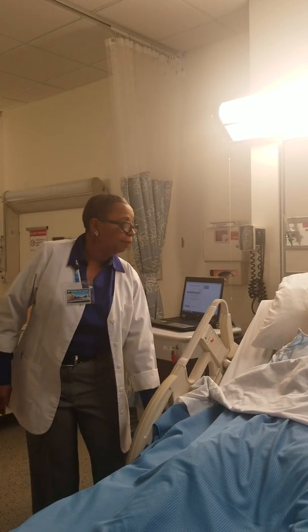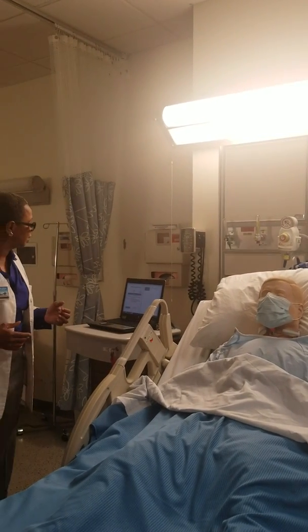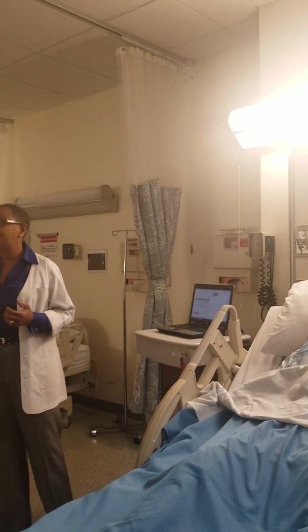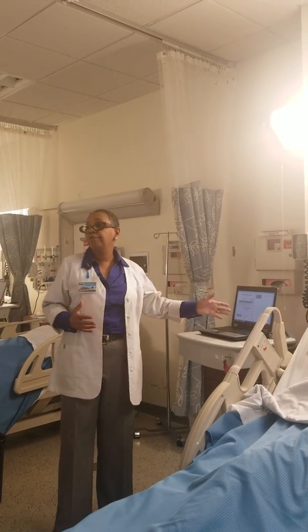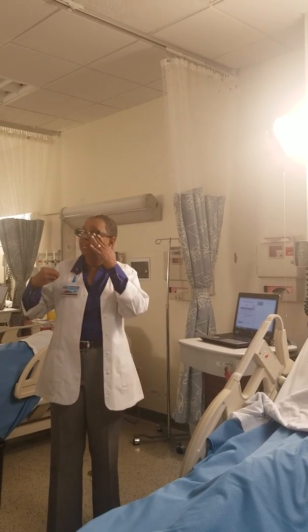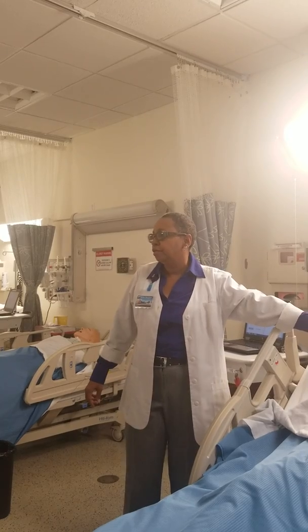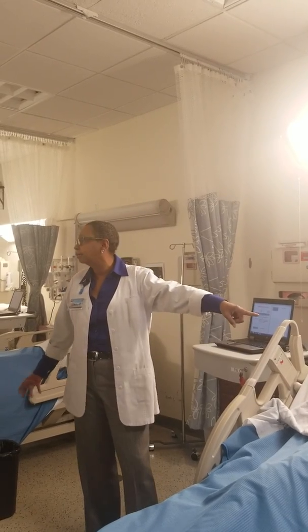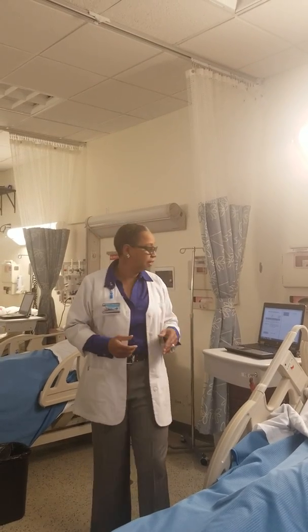Okay. So I come upon this patient. This patient has a, and they talk about central line dressing change. Sometimes you'll hear them say central venous catheter, CVC, PICC. All that stuff really relates to the fact that it's sitting in a central location. They can call this guy a central venous catheter. They can call him a single lumen central line. Okay? All that means the same thing.